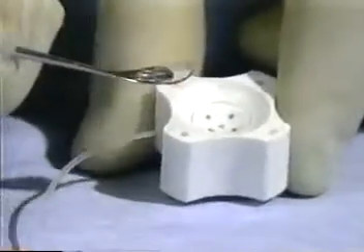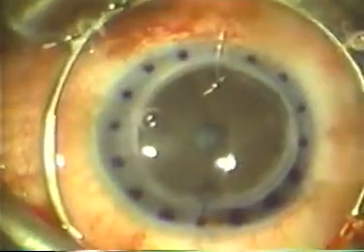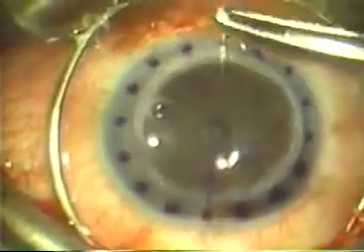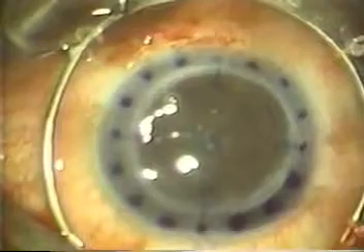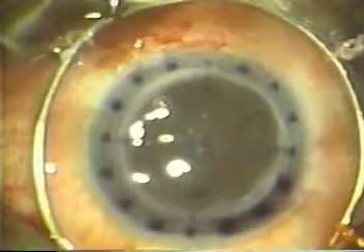The donor corneal button is removed from the well of the cutting block and held with forceps at one of the four circular marks and positioned on the eye. A suture is placed in the donor cornea at the center of the circular mark and in the recipient cornea at one of the 16 radial marks. After the first suture has been tied, the second suture is placed in the donor cornea at the center of the circular mark 180 degrees away and in the recipient cornea at the radial mark 180 degrees away. This ensures even distribution of the donor cornea in the recipient bed with no guesswork. The third and fourth sutures are placed in a similar manner. The remaining radial marks on the recipient cornea can be used for additional suture placement.